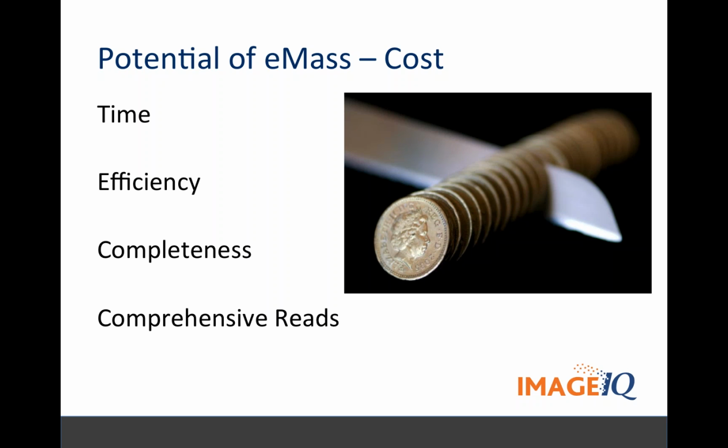Right. Yeah, that's a good point. Well, and because you've got the efficiency and that kind of stuff, it doesn't cost you a bunch of time to have somebody take a look at test cases and stuff like that. And look, the bottom line is, and you all know how this works if you've done any kind of imaging in clinical trials, you get to the end of your trial, you go, okay, let's gather up all the imaging time points and all the imaging data, get it to the biostats team with everything else, and then you start discovering that you're missing things. And that is the worst time in the universe to figure that out, right?